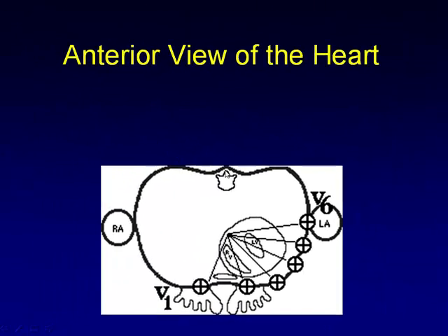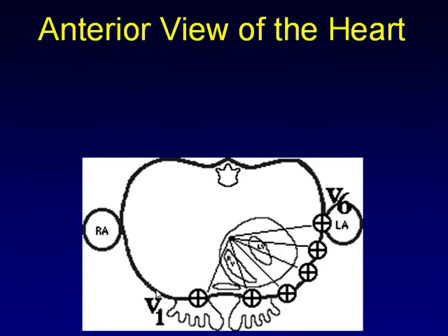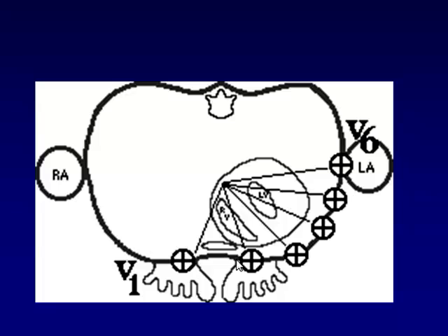Very important. Okay, we can see, as we told you, the heart from different views, from different directions by our leads at the same time. Okay, the same electricity from different views. For example, if you see here the precordial leads, yes, I will give you a video on how you can put the leads on the body, so you can obtain the information very well by this video.